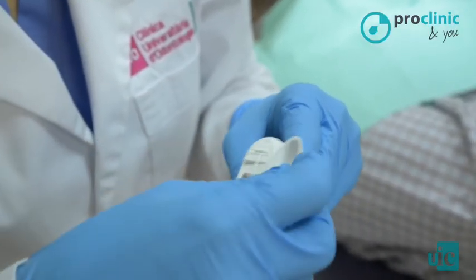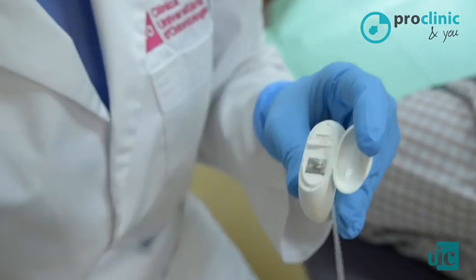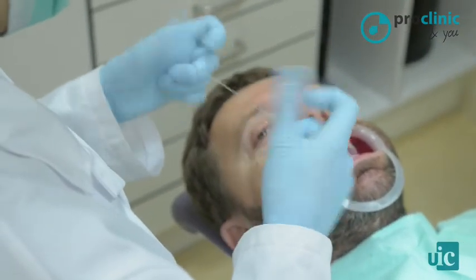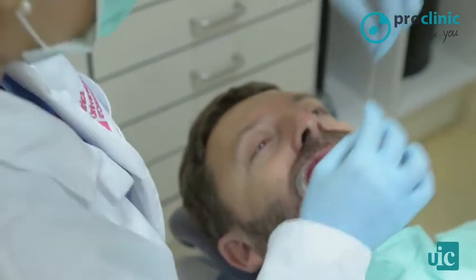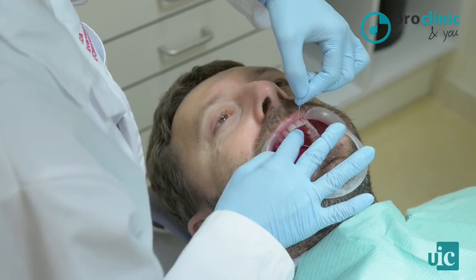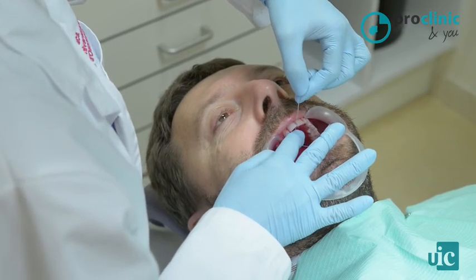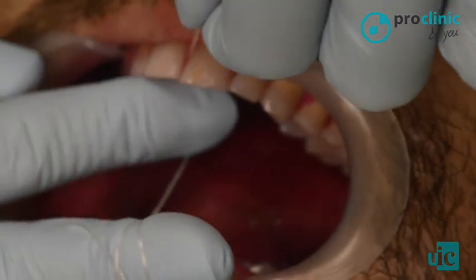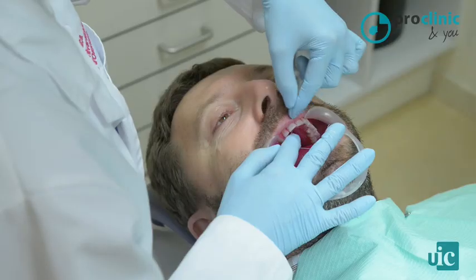With the dental floss, you should take about 20 to 30 centimeters. Roll it with the middle finger of each hand and work with the index finger and thumb. It is very important that you make a sliding movement to overcome the contact point of the teeth. Once done, you can clean both sides. You can go to one side and to the other.